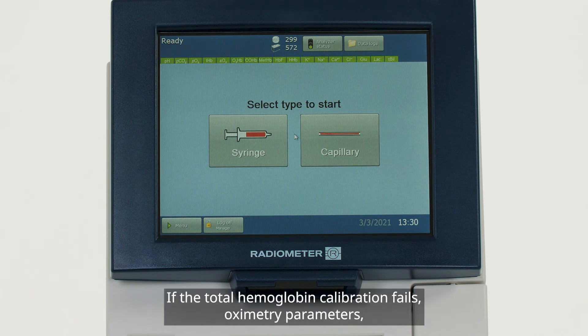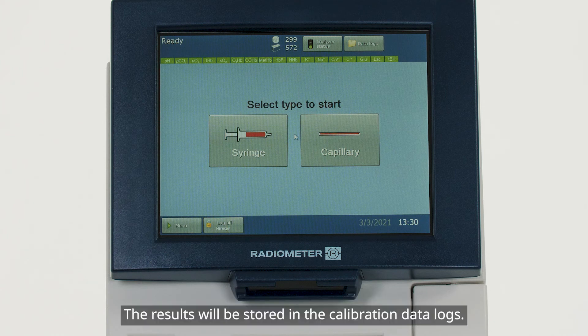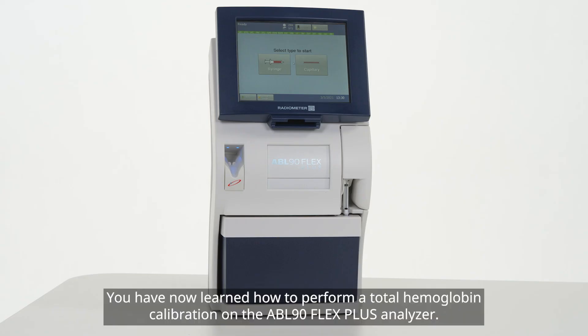If the total hemoglobin calibration fails, oximetry parameters including total hemoglobin will turn red on the parameter bar. The results will be stored in the calibration data logs. You have now learned how to perform a total hemoglobin calibration on the ABL90 Flex Plus analyzer.